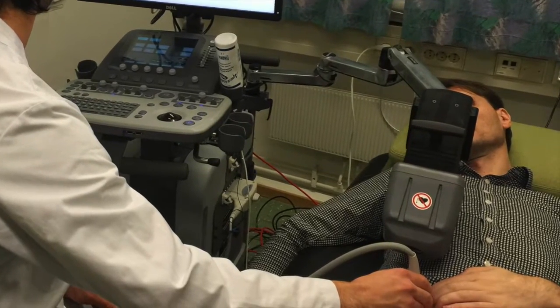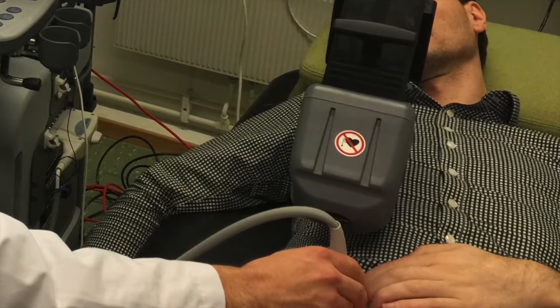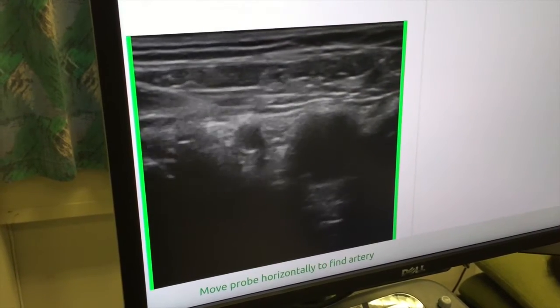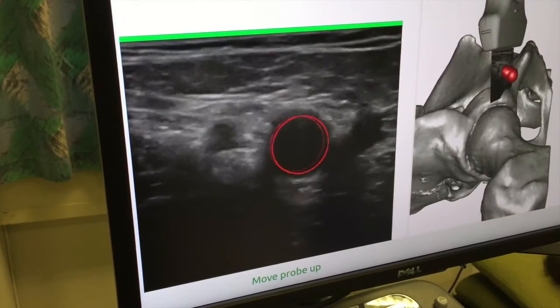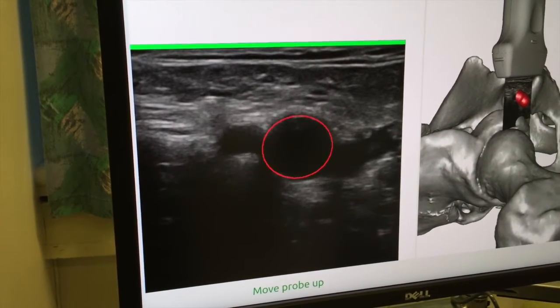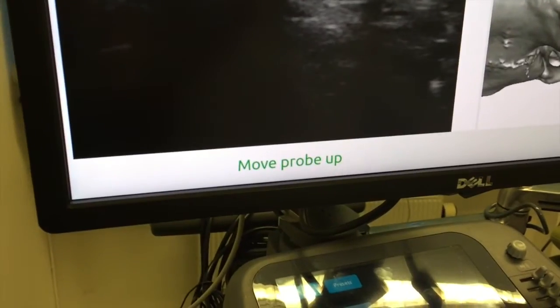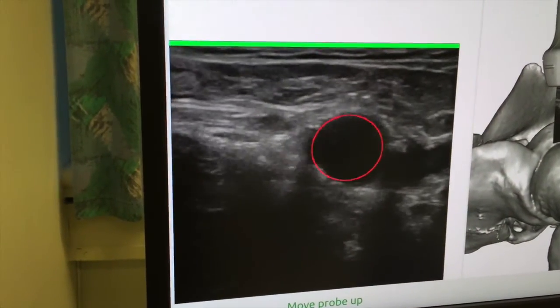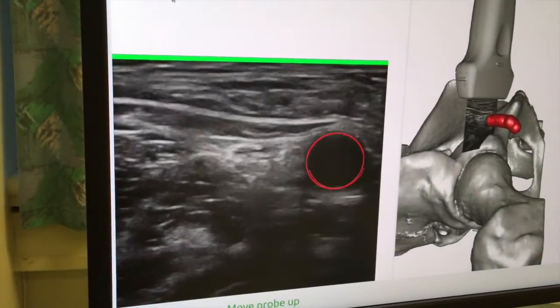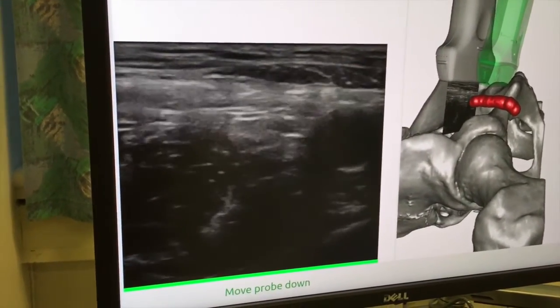If something moves, or if the user needs to reset the system for some other reason, just lift the probe and place it back on the patient. After placing the probe, move it to locate the artery. The assistant will automatically identify the artery and reconstruct it in 3D. After the artery has been identified, move the probe as indicated by the system, both with a text message and a green bar — which here is on top of the image — telling the user to move the probe upwards. A green bar on the bottom tells the operator to move the probe down.